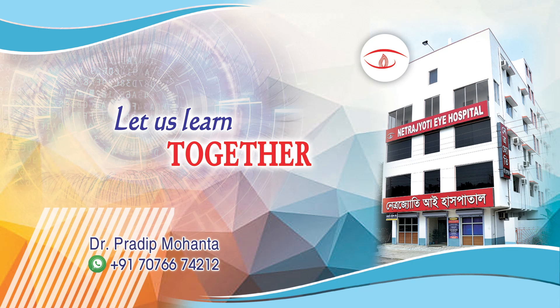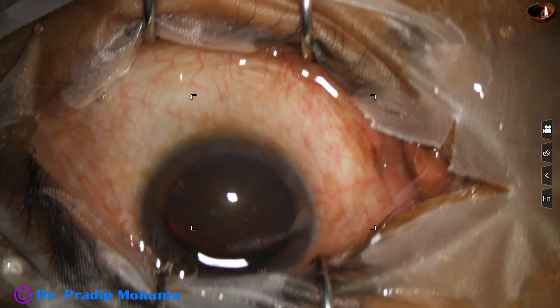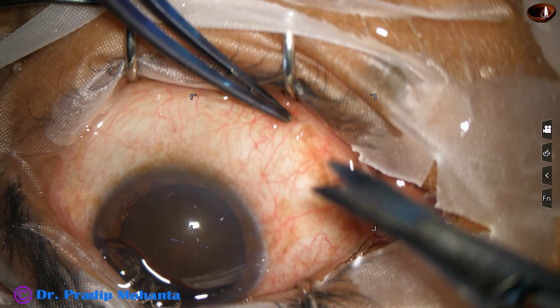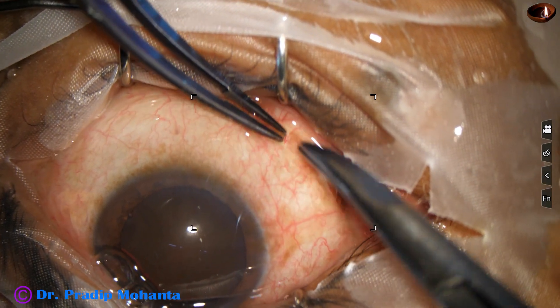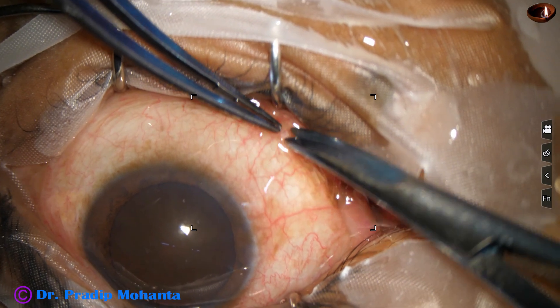Friends, welcome to my workplace at Ranaghat, West Bengal, India. Let us see the management of a hard cataract under topical anesthesia. It is better to operate such cases under peribulbar block, but this patient has insisted too much for topical anesthesia.